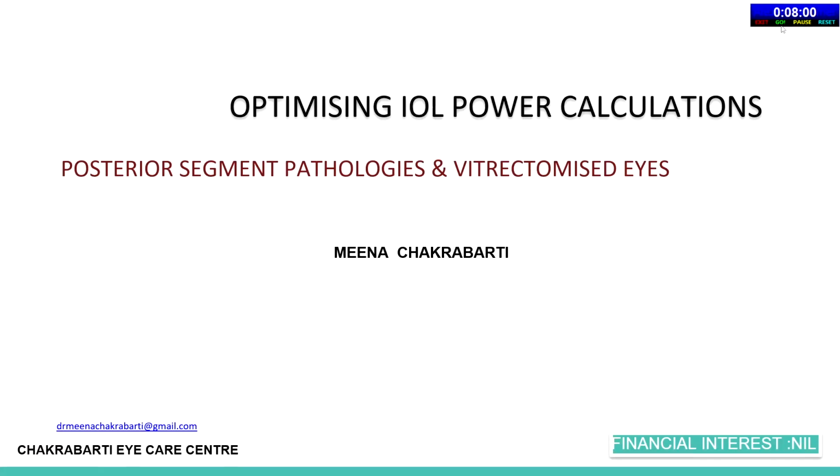Actually, Hoffer Q, I read somewhere, is a formula which Hoffer himself wants people to disregard. It has to be abolished. But people still have been using Hoffer Q. In fact, the recent publications also show that. So he came up with the Hoffer QST formula.